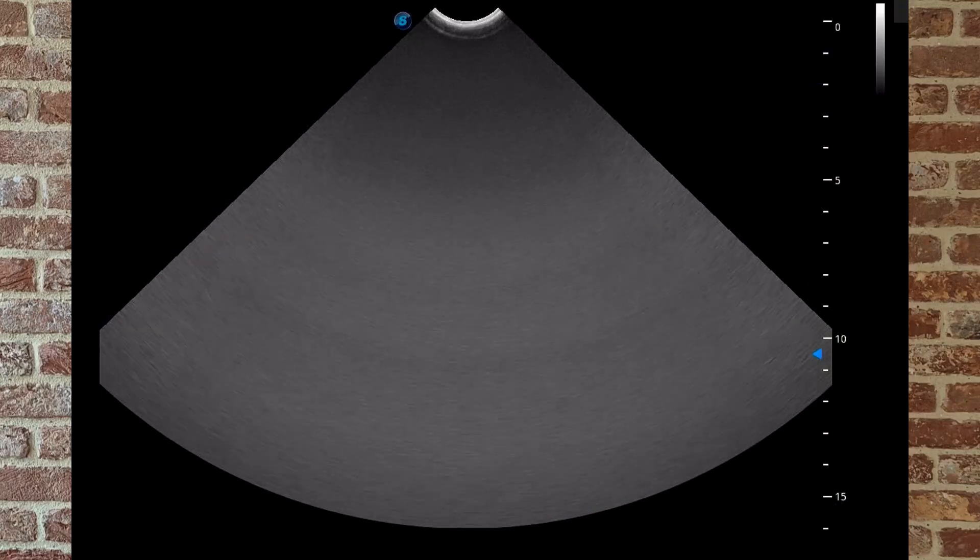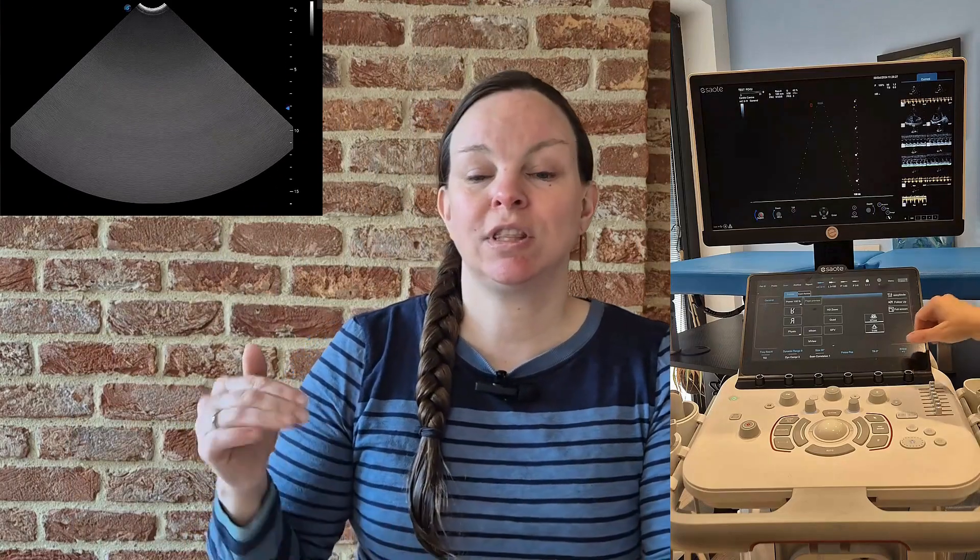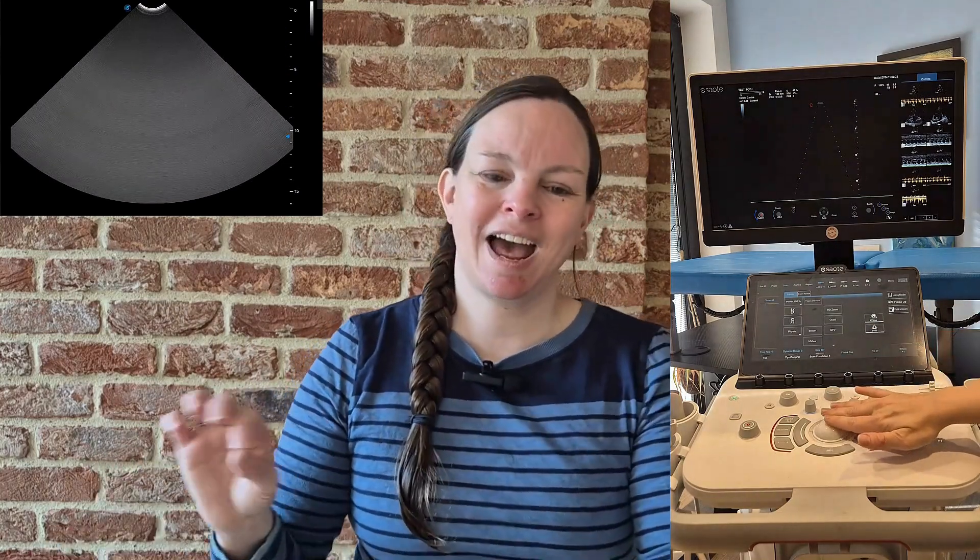On most machines the focal zone is marked with a triangle or chevron on the edge of the image. You can move it up and down using the trackball or a button labeled 'focal zone' or 'focal position.' Place it at or just below the structure you are interested in — that's where you'll get the most quality diagnostic image. Some machines allow you to set multiple focal zones, which can be useful, but remember more zones means a slower frame rate. For anything moving, like the heart or a panting animal, stick to one focal zone.